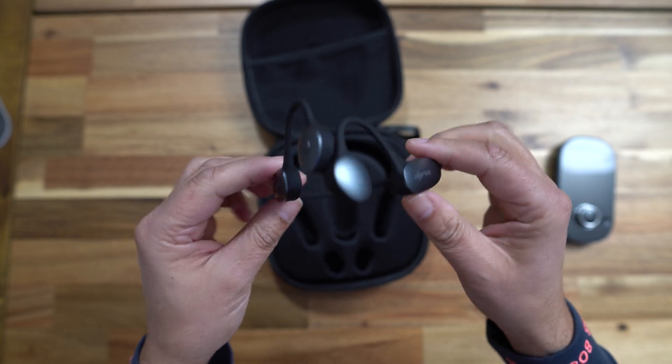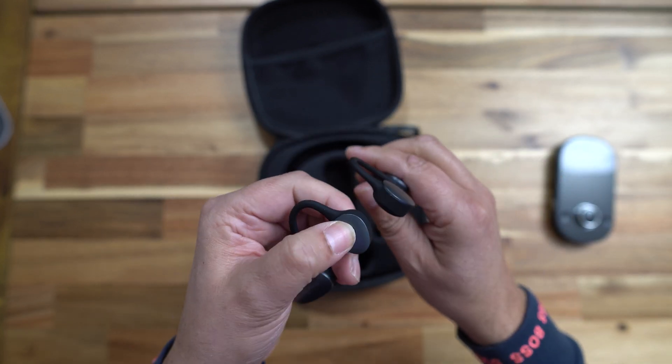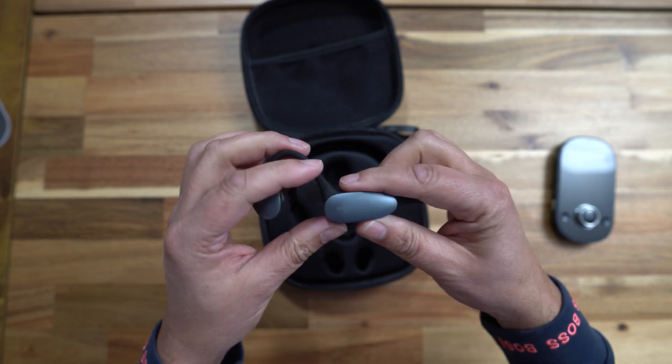Then we have the main event — the earphones themselves. These are made from a very tough but bendy material, which I've seen before in bone conducting earphones for music. Looking around them, you've got some volume buttons and an action button that allows you to make and take calls. They're very light and they feel premium.